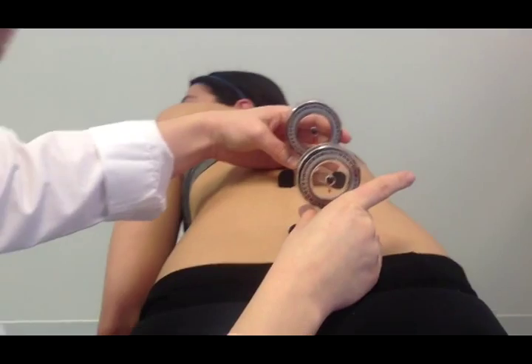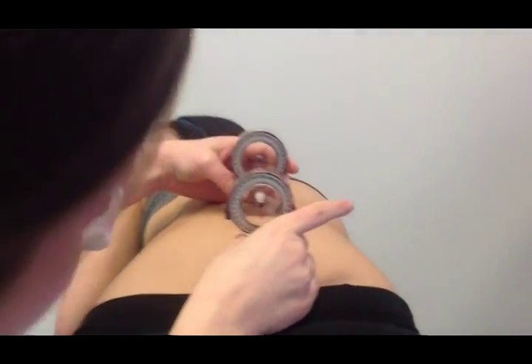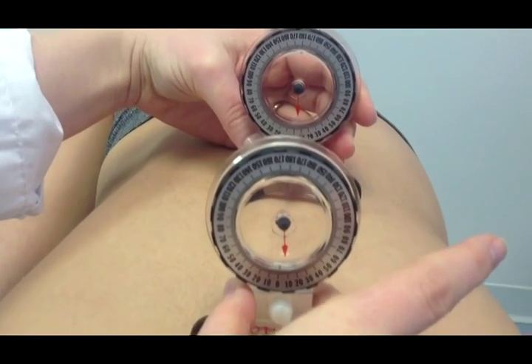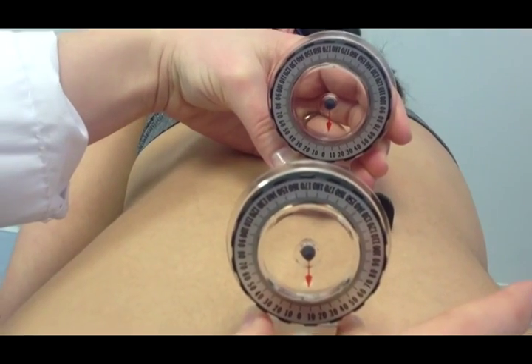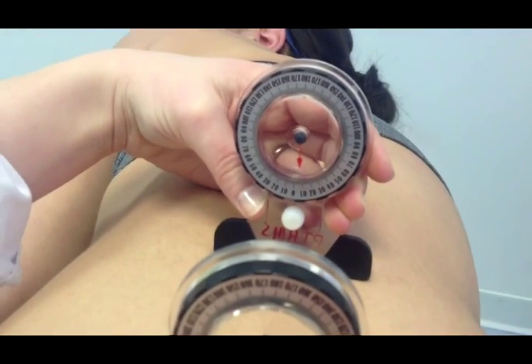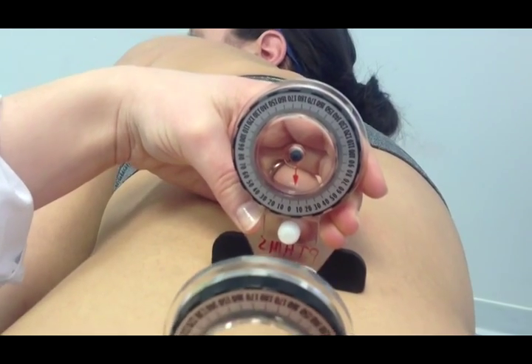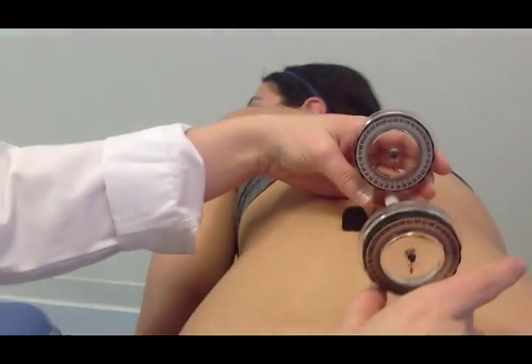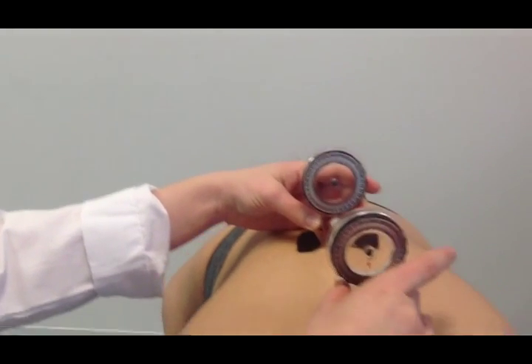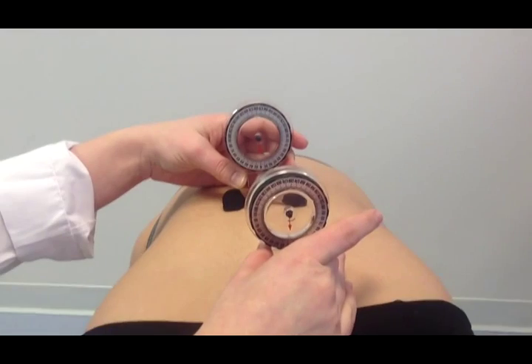Go ahead and rotate to the other side. I have about 8 degrees at S1 and about 2 degrees at T12. Therefore, it looks like Mallory has about 6 degrees of rotation at her lumbar spine. She does have a slight difference between both sides, and that is normal and not something to worry about, but definitely note it in your documentation of the patient's chart.